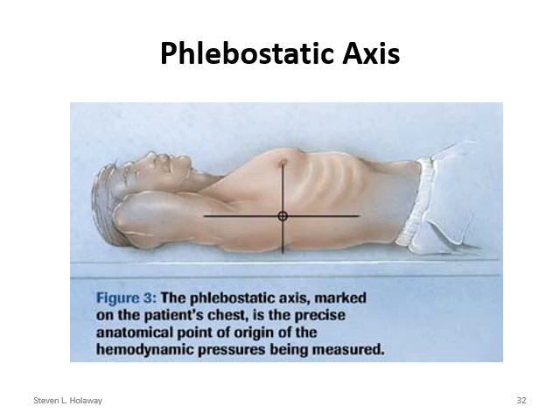Now here's the phlebostatic axis. You do need to know where the phlebostatic axis is located. You need to know the fourth intercostal space, mid-axillary line. To get an idea, it's usually around nipple line. Again, can only say usually. Your best bet is to count your ribs and count down to that fourth intercostal space. We choose this area because it's typically about the level of the right atrium. And that's where the majority of our measuring is taking place, around that right atrium.